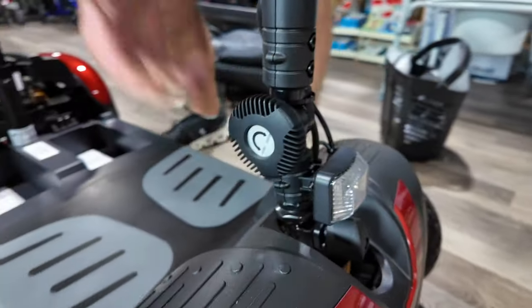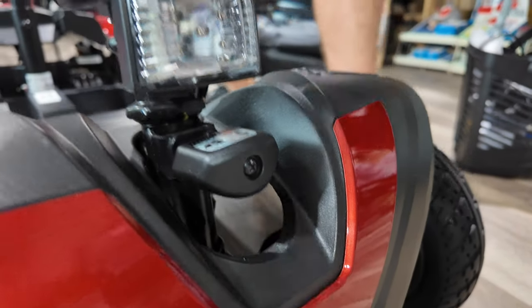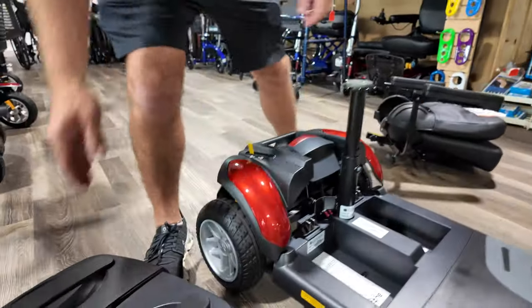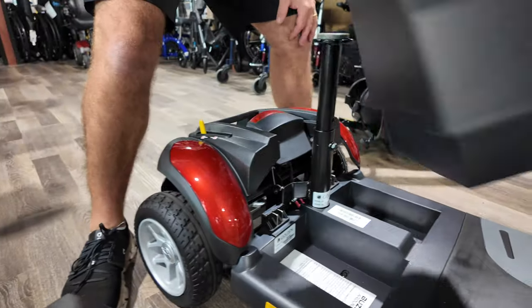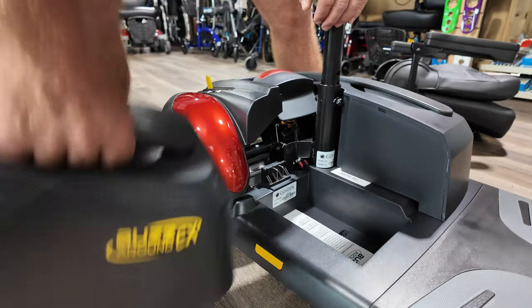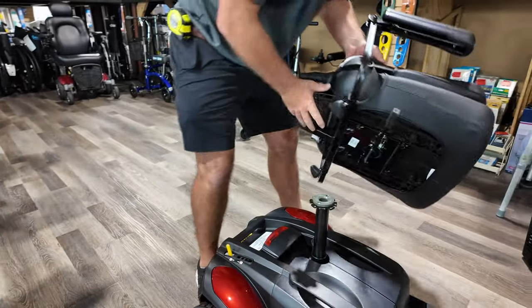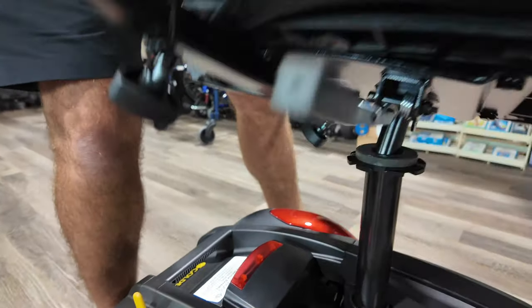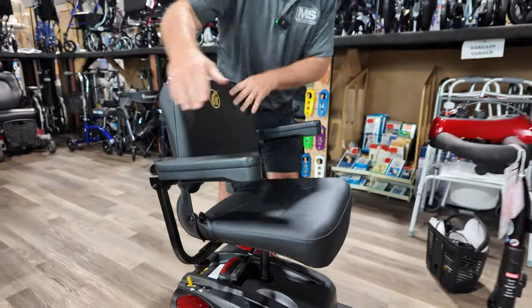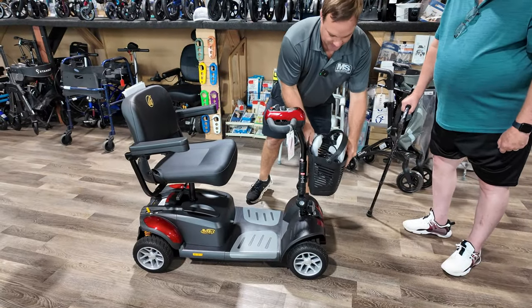Loosen this, bring it back up, and tighten it. You can adjust the tiller angle but not height. Push that in and turn it. Drop the batteries in one at a time — you can't really put them in the wrong way. Grab the seat, drop it right on, put the basket on the front, and that's pretty much it.